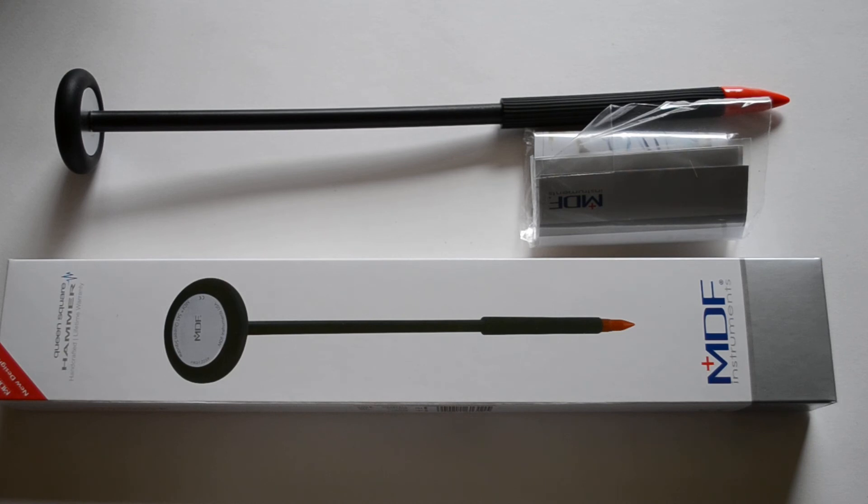So overall, very well-built, good quality, thick-handled, large head Queen's Reflex Hammer. That's the MDF 545 Queen Square Hammer available from Valumed.